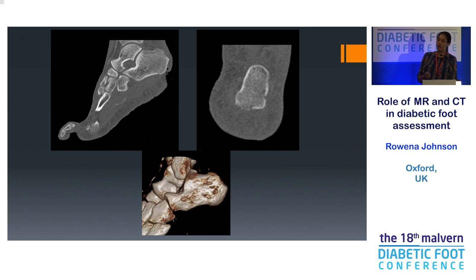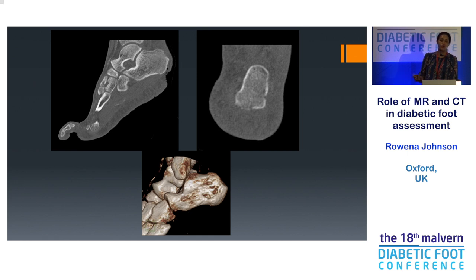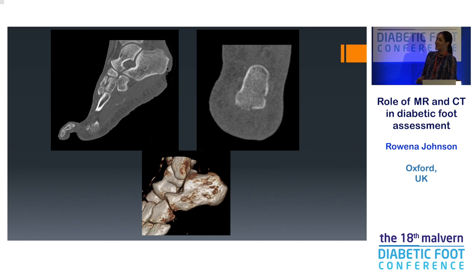These CT images show the foot in a sagittal plane — the calcaneus and subtalar joint — with soft tissue ulceration and locules of air within it. The coronal image of the calcaneus shows what normal cortex looks like: a really well-defined, crisp white line. Where there is cortical erosion, that line breaks down. The 3D volumetric reconstruction — radiologists don't find these diagnostically helpful at all, but surgeons love them in MDT. We can also add colour, and people really like that.